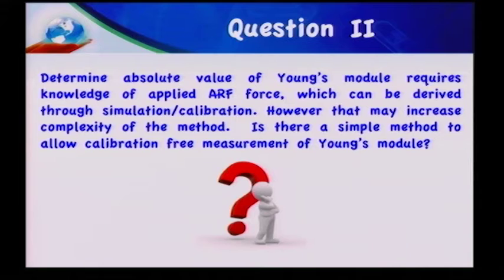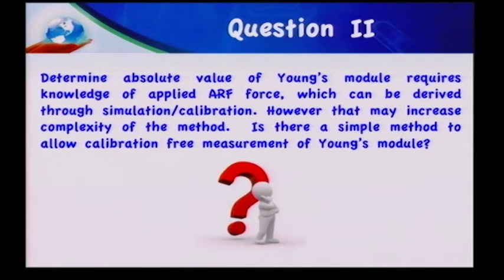So one of the questions is, it's great, we can image relative displacement, which is essentially proportional to the tissue mechanical property. But in order to quantify the Young's modulus, you need to know the force. And the force, if you have a planar geometry, probably you can calculate. But in a lot of cases, in the vascular case, for example, the geometry is not planar, it's circular. Calculating the force is not that trivial. And so we are looking for a technology which will be calibration free.